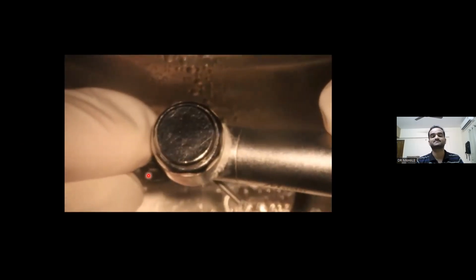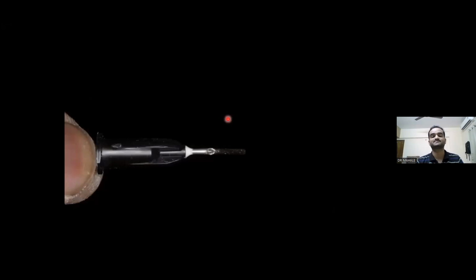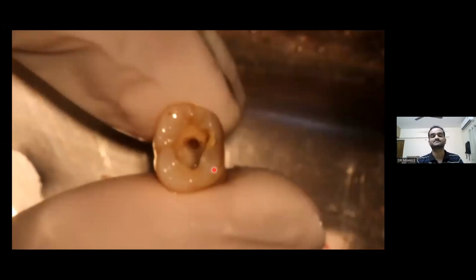This is the microtube we will get with the etchant, which I have used here to prepare this modified tube. We have to use a diamond abrasive to cut a hole in this microtube at exactly where the bend starts, and then we can insert an appropriate size of H file just to bypass the broken fractured instrument. So this is the assembly which will be prepared. This is how it is used in the tooth.